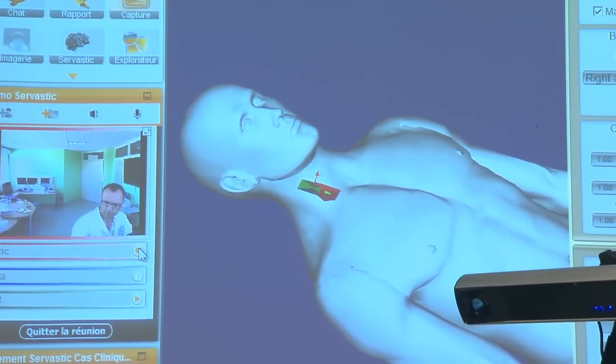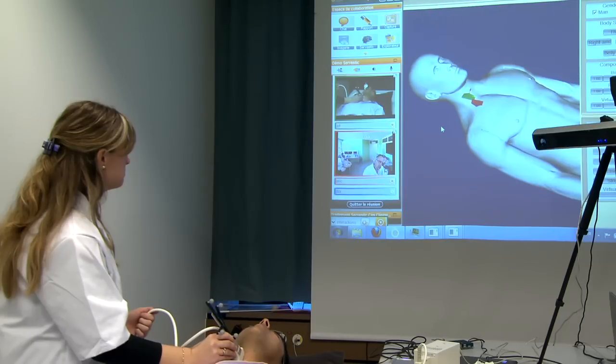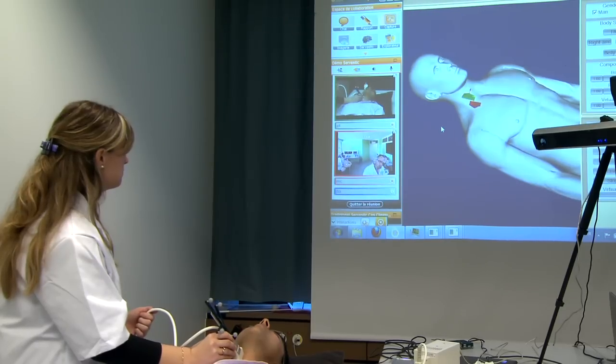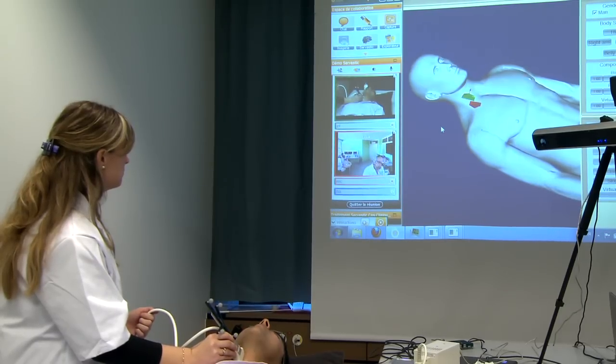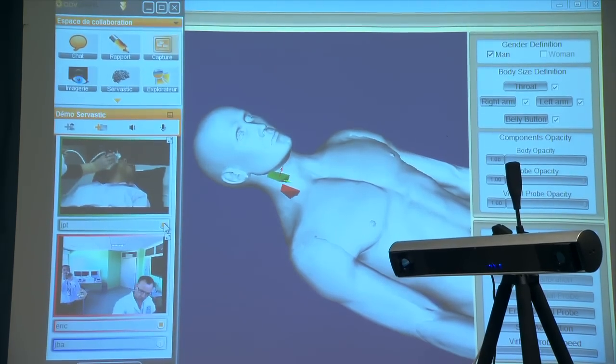Next to the ultrasound image, the software we have developed here at EPFL allows, first, to do the telemedicine — seeing the remote image — but also we have developed a system allowing the remote expert to clearly indicate the movement that he wants to see done by the local manipulator, specifically the movement of the probe.